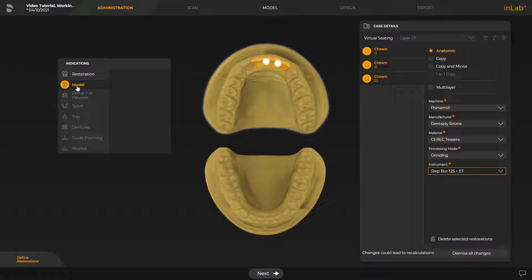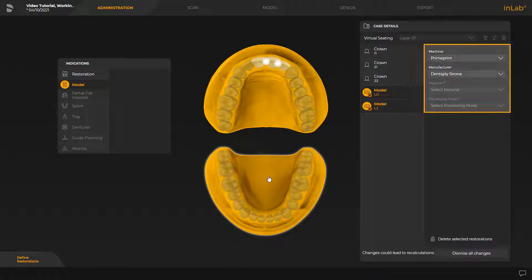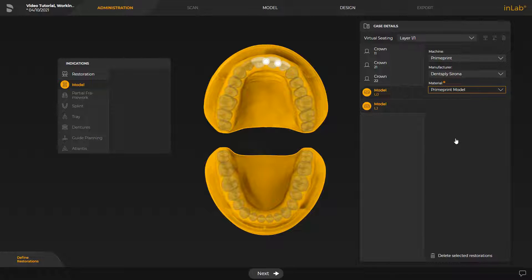We tap the corresponding jaw and set up the necessary information under Case Details to create a model. By tapping the drop-down menu under Material, a list of all printer materials is displayed and we select the appropriate material called Prime Print Model. After all information has been entered, we can move on to the next phase, the Scan phase.